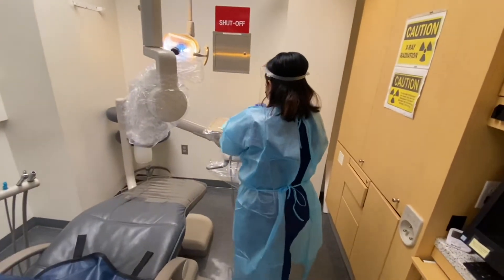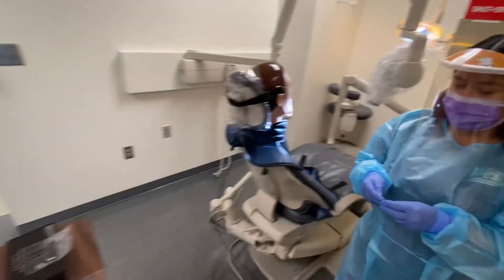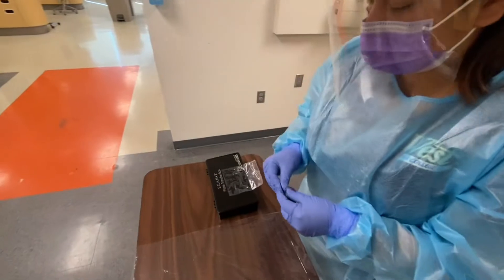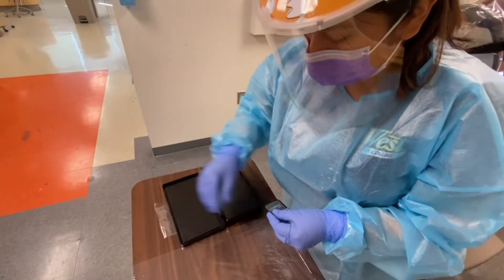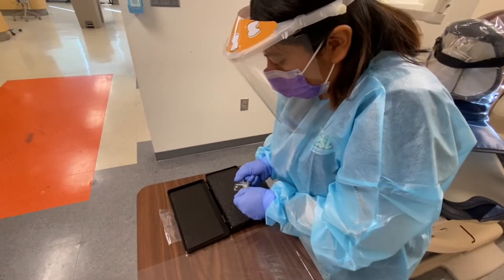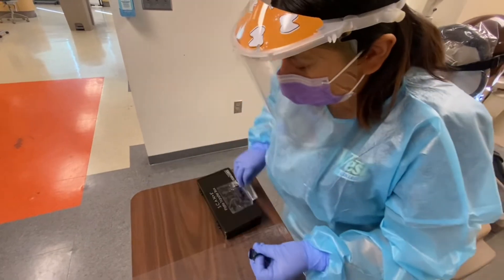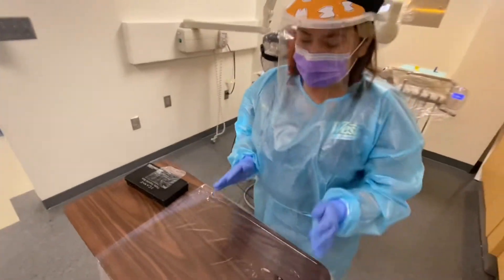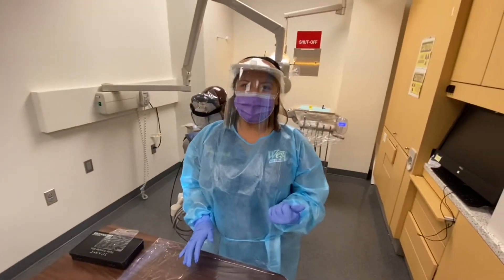Okay, now removing the film from the bite block so we could quickly transfer it into our plate transfer box so we do not get any light into the image to get an error. Just like that. And now we're ready to process the image that we just took.